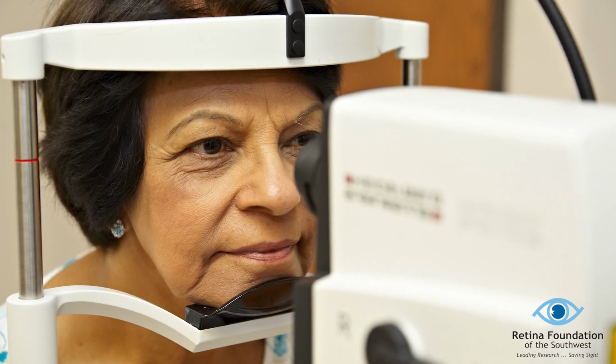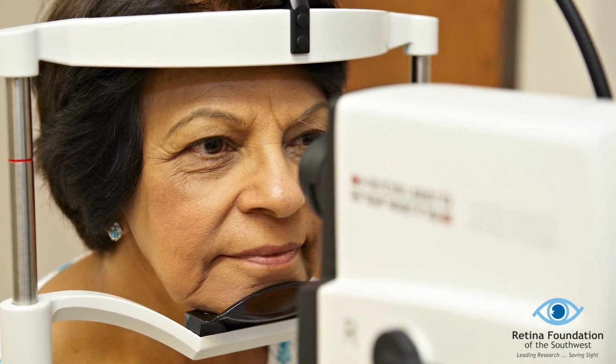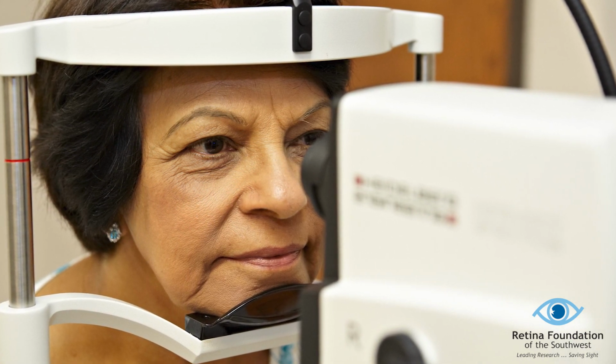In the past decade, most, if not all, patients with RP had OCT images taken when they visited the foundation. Working together with Dr. Birch, we have reviewed and identified OCT images from hundreds of patients. We used these images to generate data for training and testing the deep machine learning model.